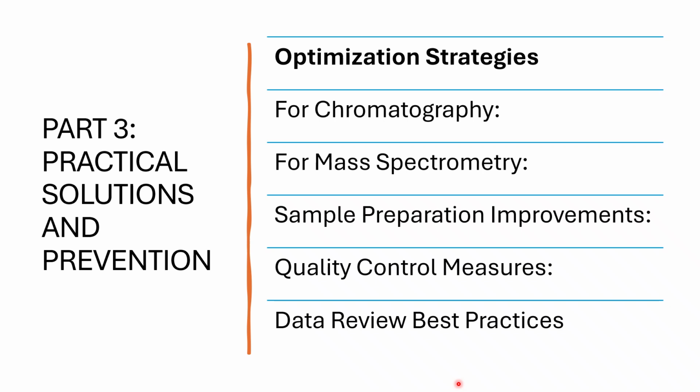Implement regular system suitability testing before each analytical batch. Monitor control chart for IS response and ion ratios over time. Validate your method thoroughly, including matrix effect assessment.